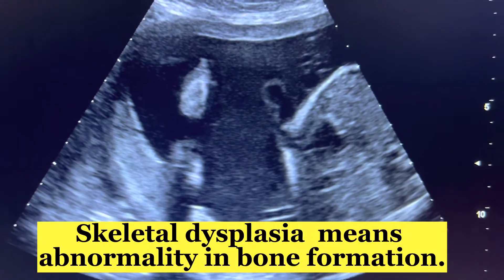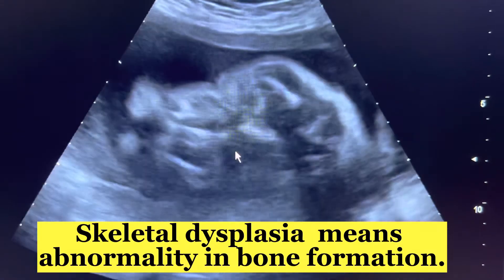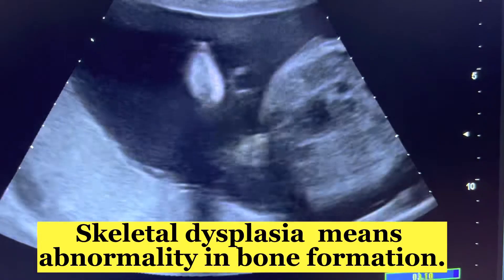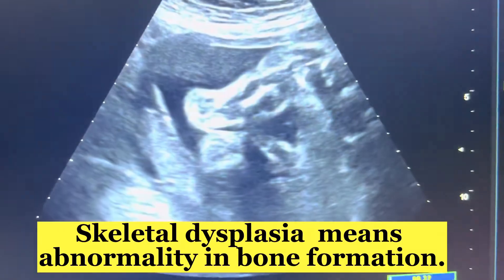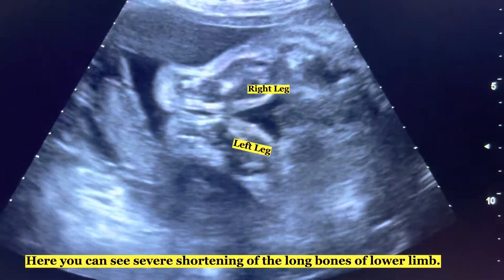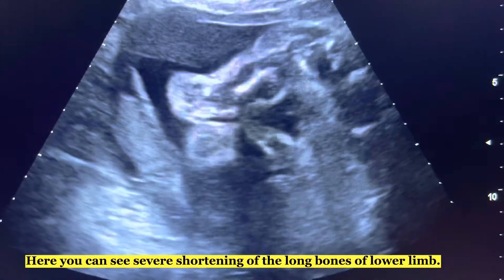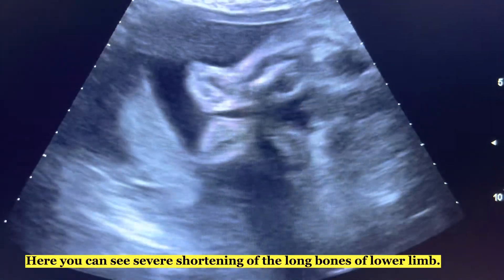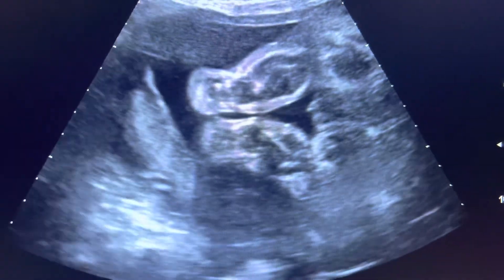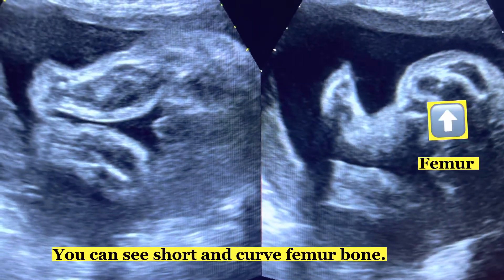Skeletal dysplasia means abnormality in bone formation. Here you can see severe shortening of the long bones of the lower limb. You can see a short and curved femur bone.